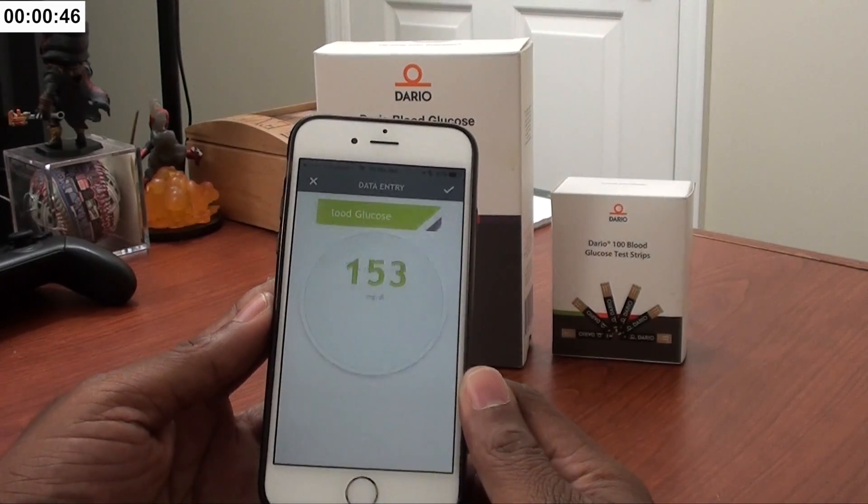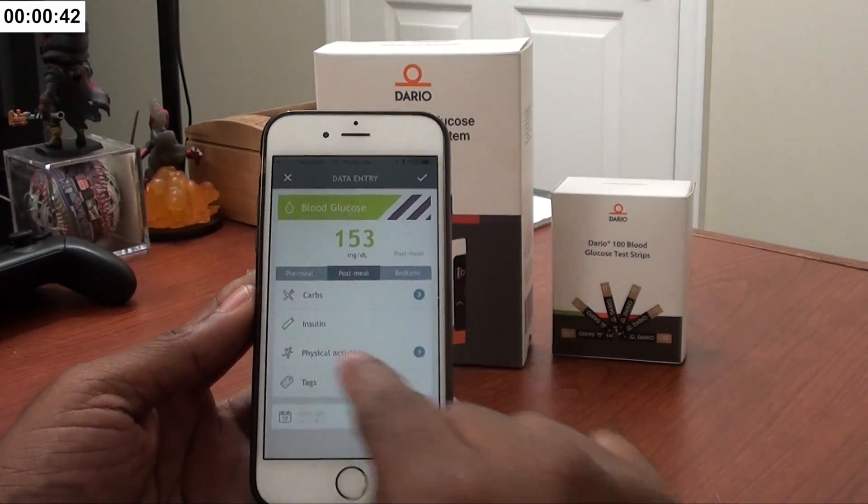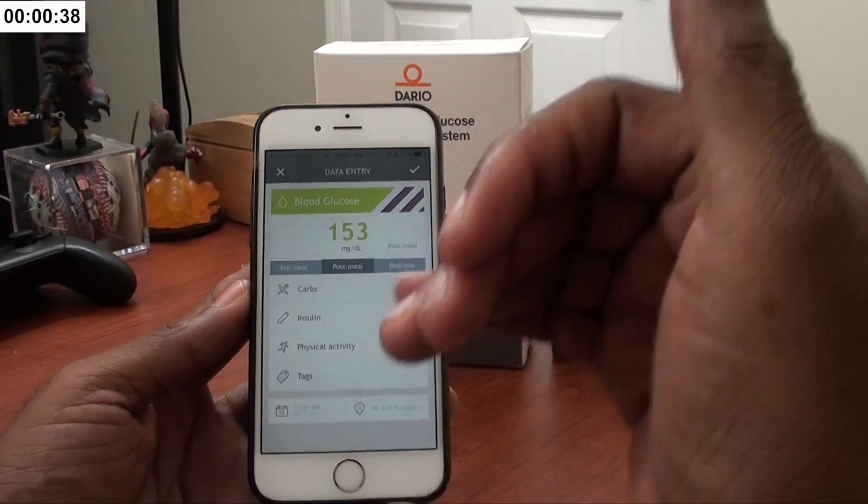My blood sugar is probably high because I had some sweets this morning — not a good thing. Yeah, really high. The good thing about this is once you have that reading, you can go in here and take notes. It keeps track of all of your blood testings.